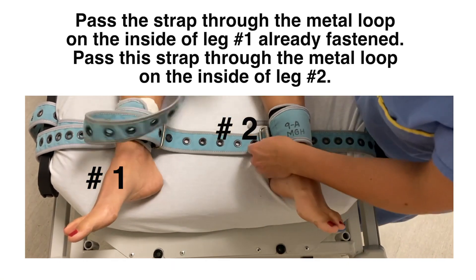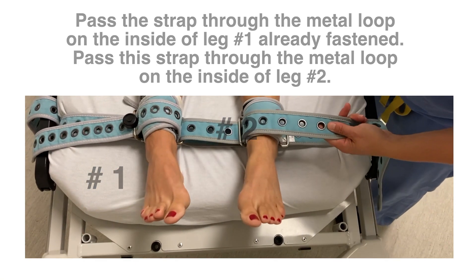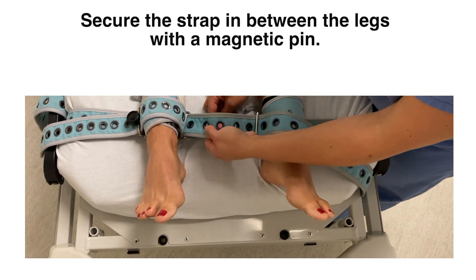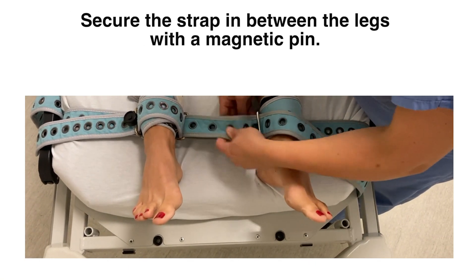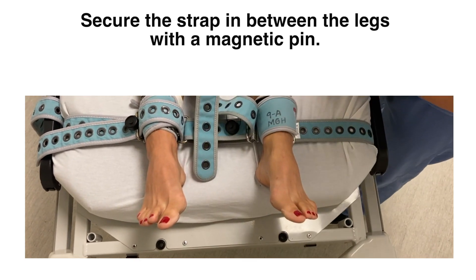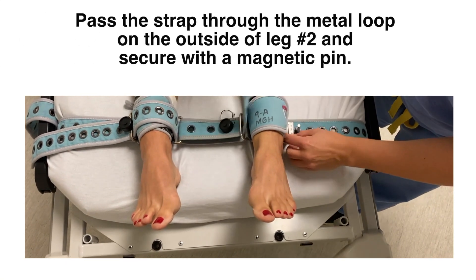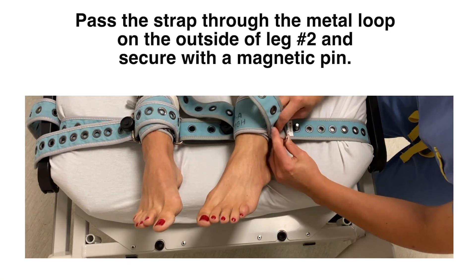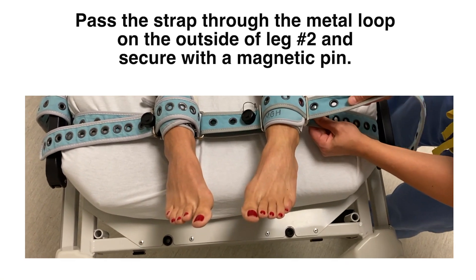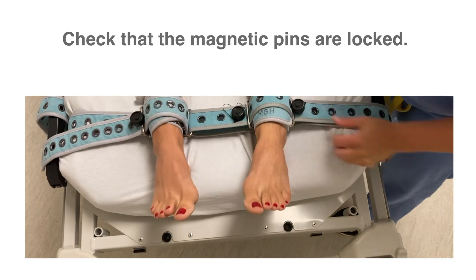Then pass the long strap through the metal loop on the inside of leg number 2. Make sure to secure the strap in between the legs with a magnetic pin. Pass the strap through the metal loop on the outside of leg number 2 and secure with a magnetic pin. Verify that the magnetic pins are locked.